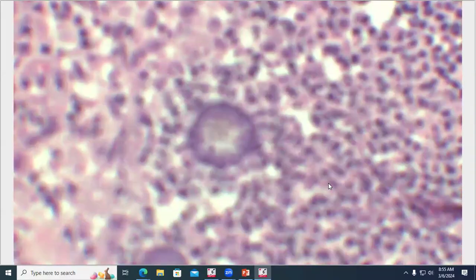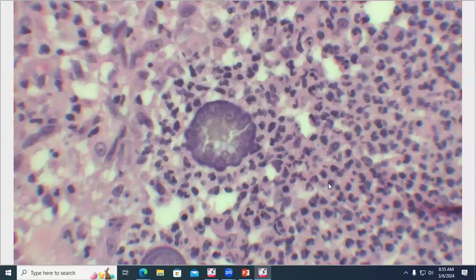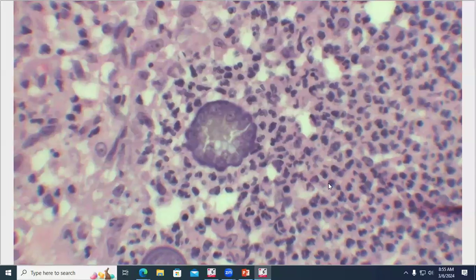Megan is keeping you in suspense. Oh, here's a good neat one. This is a good example of endosporulation. So this is Coccidioides, probably Coccidioides immitis. So coccidioidomycosis in this case, in this cat.